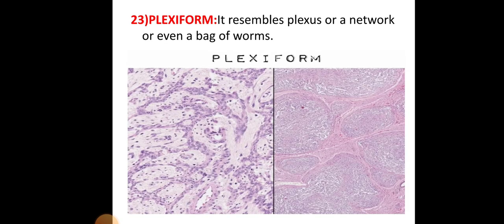The plexiform pattern resembles a plexus, a network, or even a bag of worms.